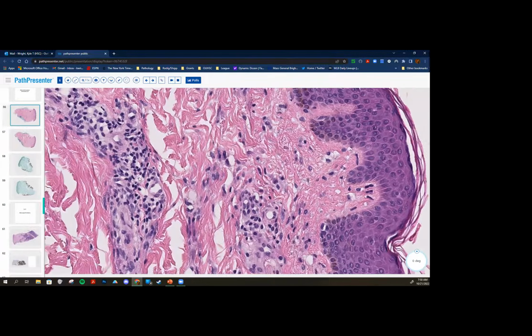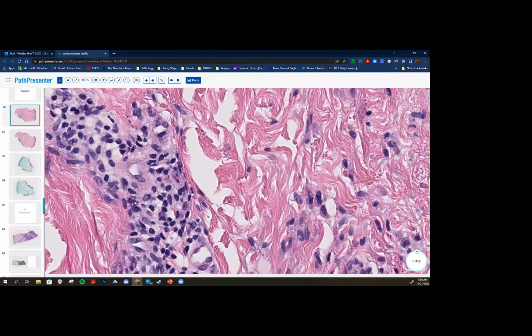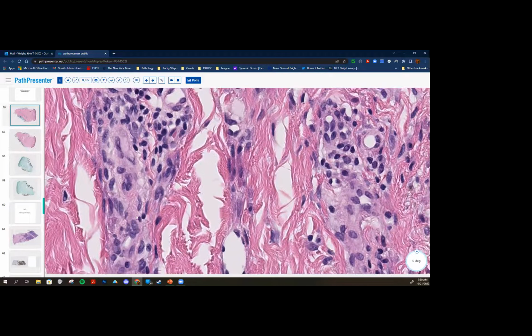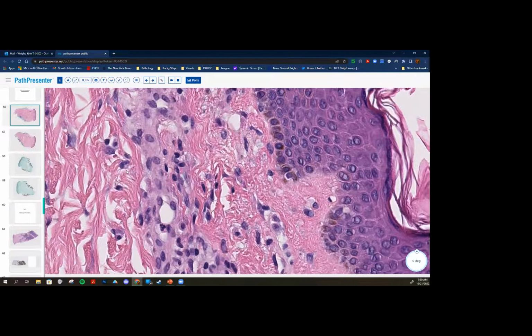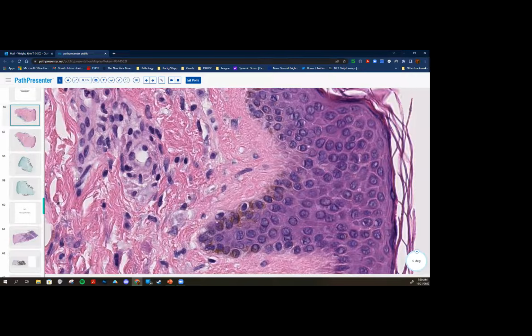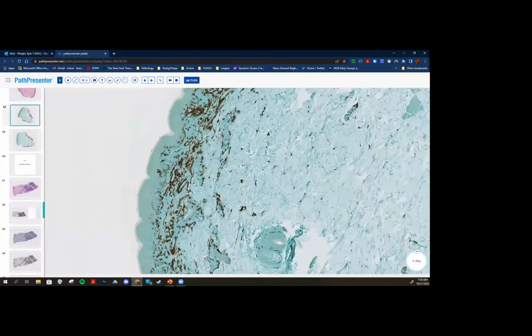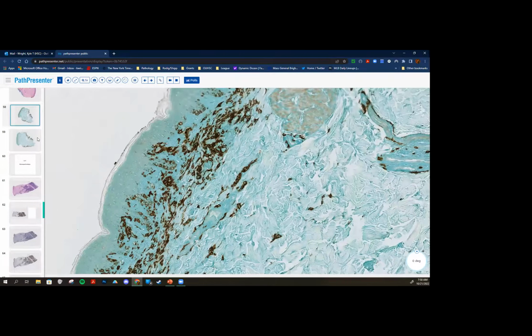If you look at the infiltrate, you can see that these cells are much more reniform or oblong, with long elongate nuclei, no prominent nucleoli, and abundant cytoplasm in some of these. And some of these cells actually are fairly dead giveaway if I can find some good granulated ones. These are a bit better. So these oblong, ovoid shaped nuclei, moderate amounts of cytoplasm, and kind of granular. This, I believe, is the c-KIT, or CD117. Those are all positive for CD117 or c-KIT.